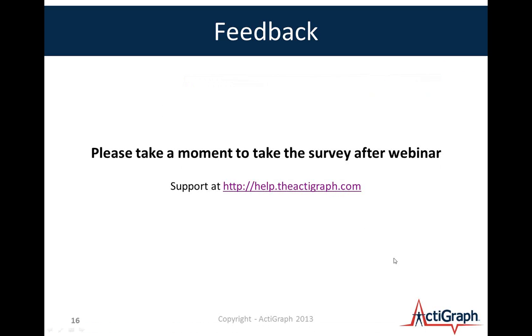So we're basically at our 1 hour limit. I want to pause here again before we close out and take any questions that we might have. So Brian, if you have any that we can address, we can try to do that now. Sure. We just got one in about proximity sensing. Is that going to require a new hardware device to do that?